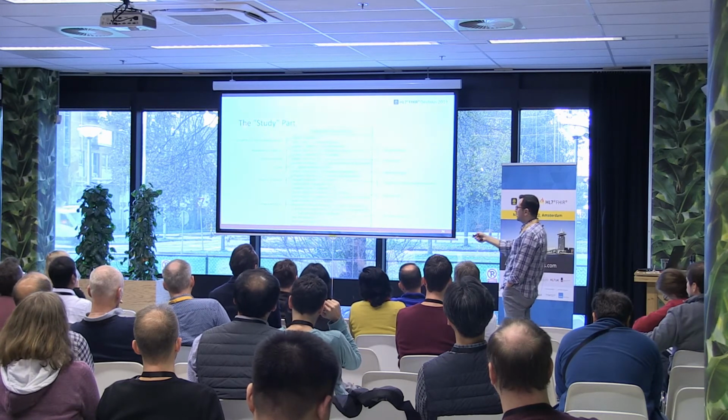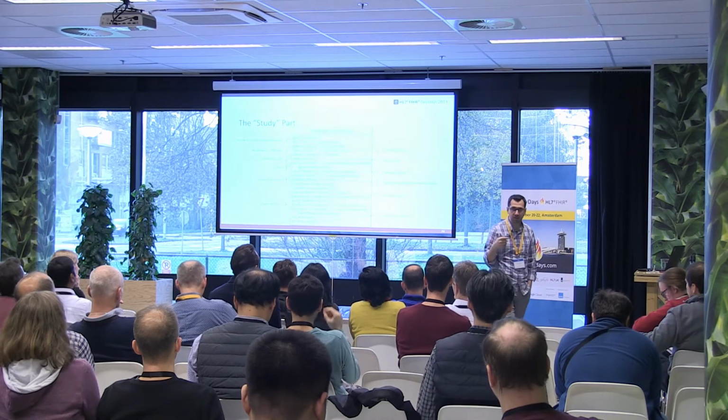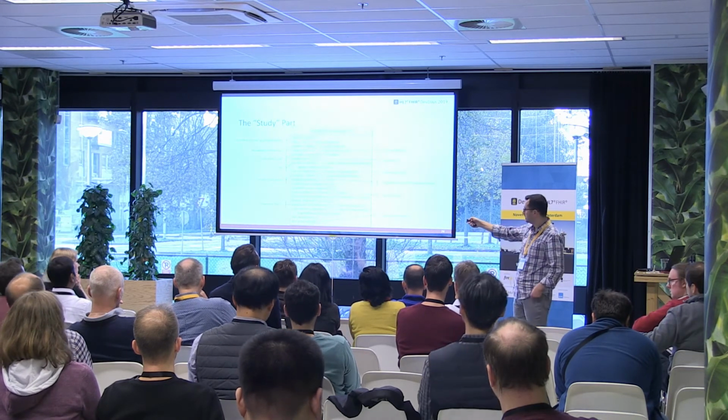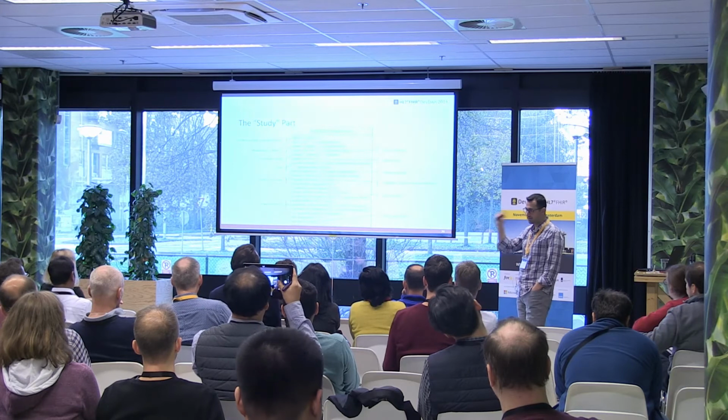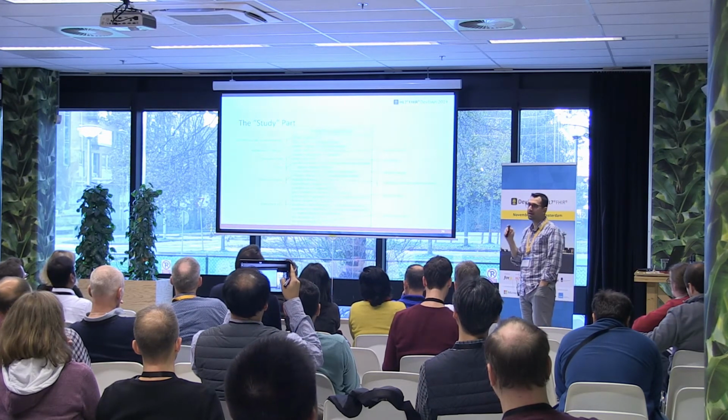Again, accession number is there useful to the end user. That's what you want to show to the end user. But if you want to make any API calls, you definitely want to use the study ID. That's the ultimate way of finding things and being sure that you're getting exactly what you're asking for.